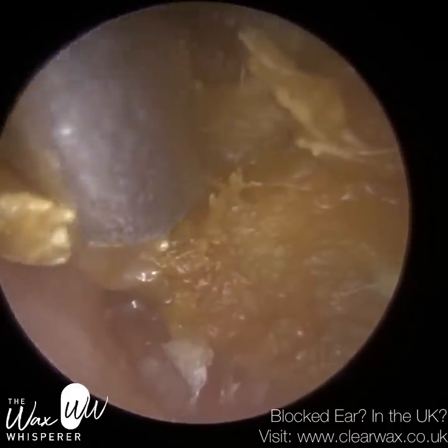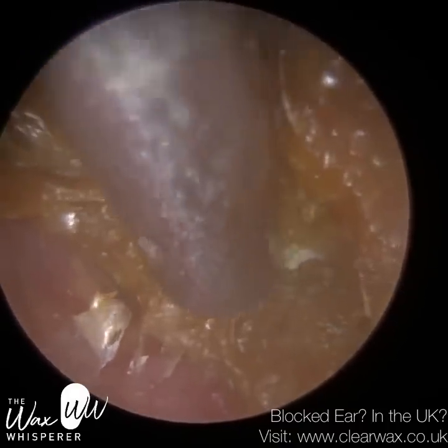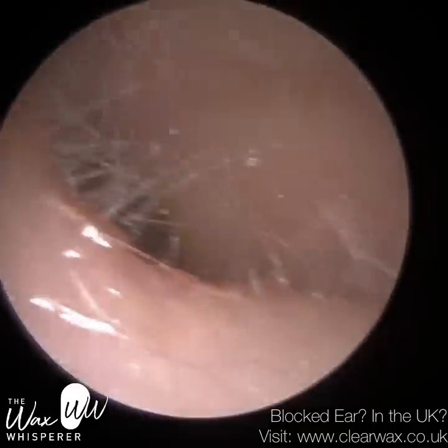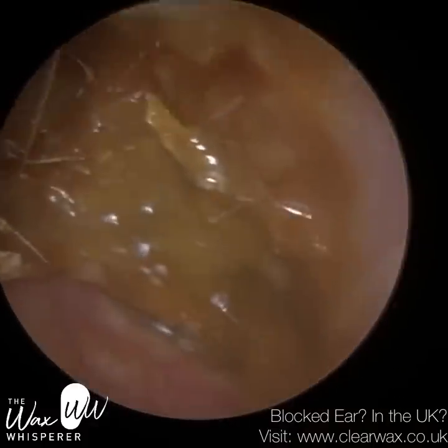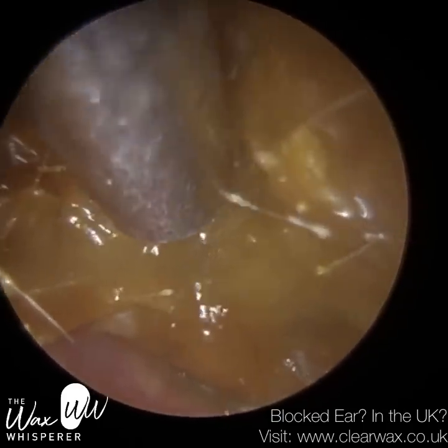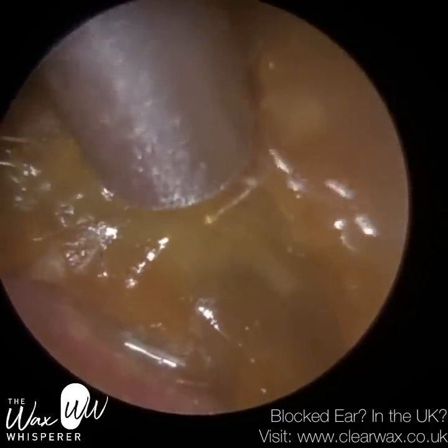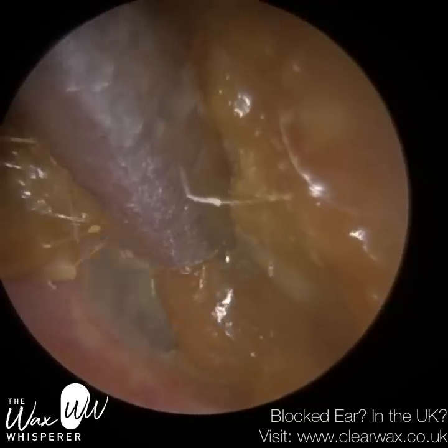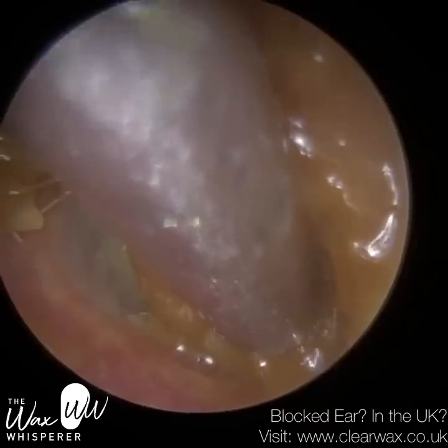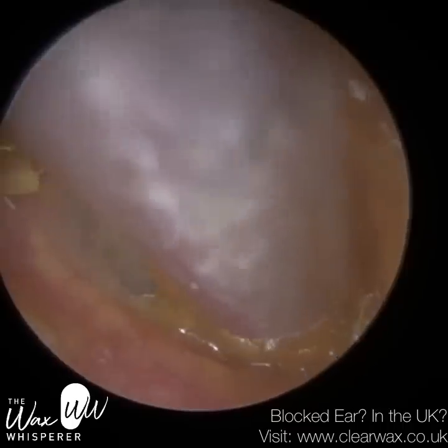I'm looking for daylight — I just want to see the eardrum. I can just see it to the left; there's a little blue tinge as the eardrum appears and resurfaces. This gives me a much better idea of how thick this final layer is. I've just put some more drops on, hoping they can penetrate between the wax and the eardrum to loosen it, as it is impacted. Slowly but surely we're seeing more and more of the eardrum — it's seeing daylight for the first time in a very long time, I suspect.